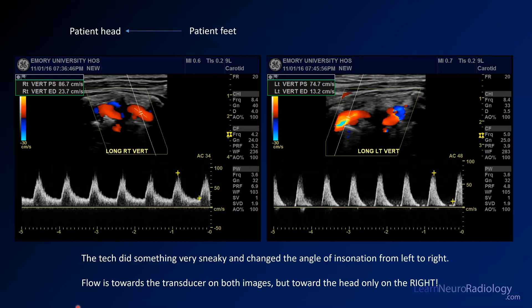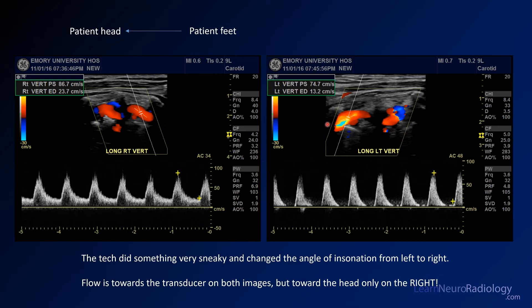On the ultrasound, the tech has done something tricky — they've changed the direction of insonation. On the right vertebral artery with normal forward flow, you see red flow toward the transducer with insonation going this way. On the left side, the insonation is now away from the transducer, so the red flow is actually going toward the feet, meaning the left vertebral artery flow is reversed. The waveform here is also different, so be careful — techs will sometimes flip the insonation direction on you, so you have to look at the angle of insonation carefully.